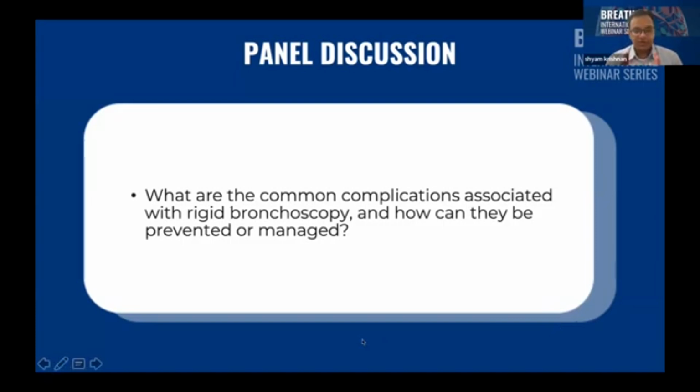I mean, start with the smallest size which you feel can ventilate the patient properly, and you can pass the instruments you require through it comfortably. And position, obviously, like the head elevation, neck extension, so that the oral, the pharyngeal and the laryngeal axis is somewhat parallel, so that you can straight away pass the scope.